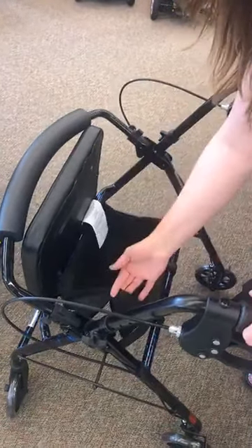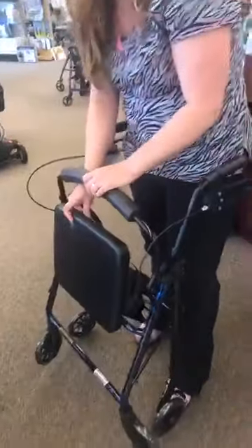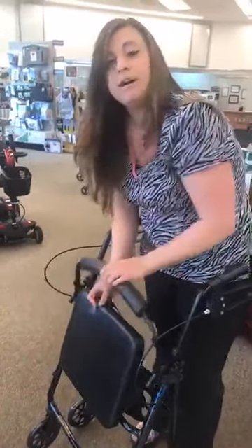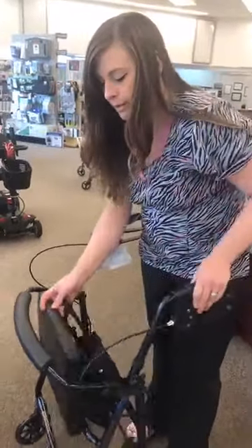This has a cloth basket, and this has the straps. So you simply pull up on that strap, and it's gonna fold it. This one does have a folding backrest to it as well, so it's gonna make it a little bit more compact to get it in a car a little bit easier. Not all of them have that folding backrest. This one is just equipped with it. It's just this particular model.